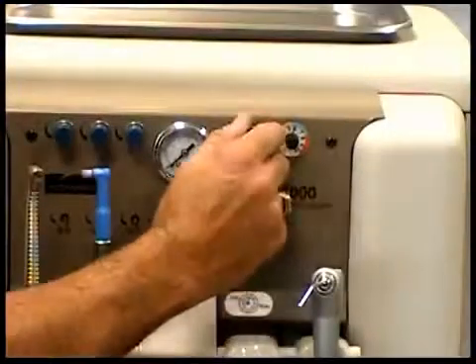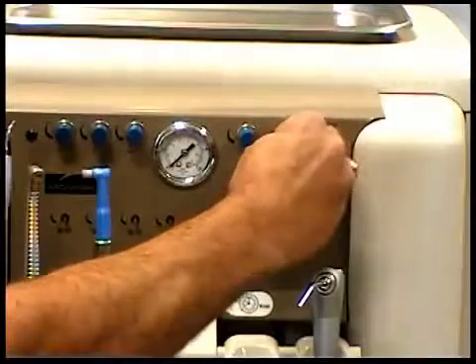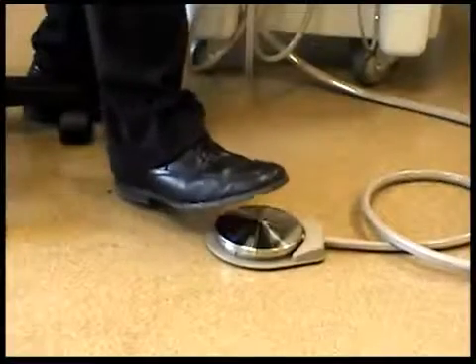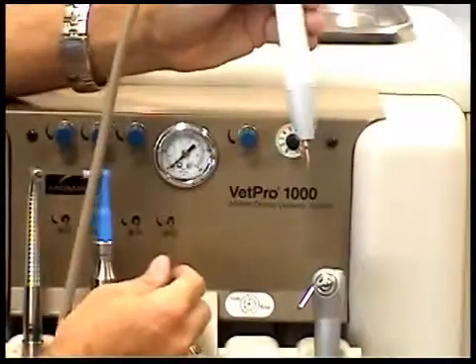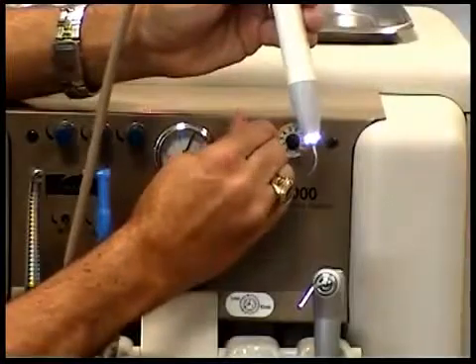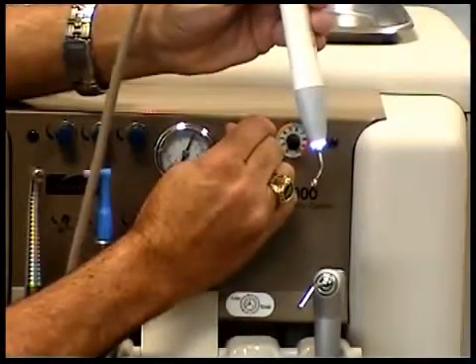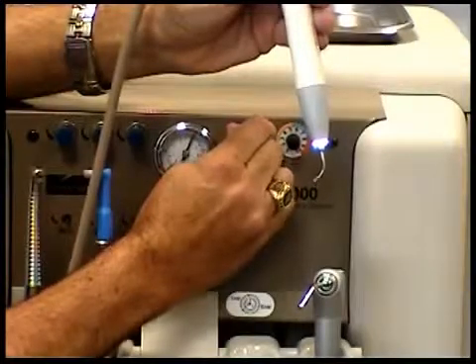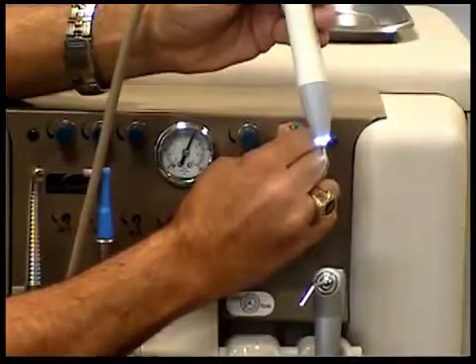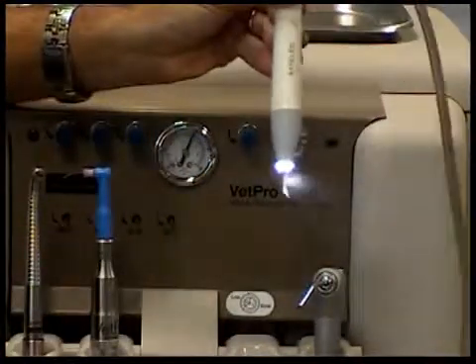Turn the scaler needle valve off by turning the blue knob all the way to the right. Turn the scaler intensity knob all the way to the left. While fully depressing the foot control, turn the scaler needle valve knob to the left until droplets flow from the tip as shown. Next, turn the intensity knob to the color range appropriate for the tip. Your scaler is now ready for use.